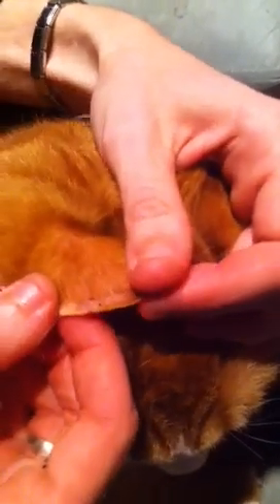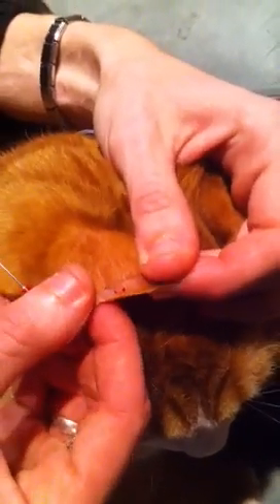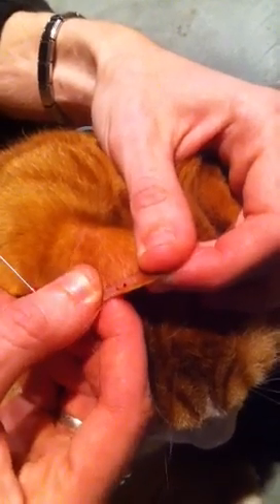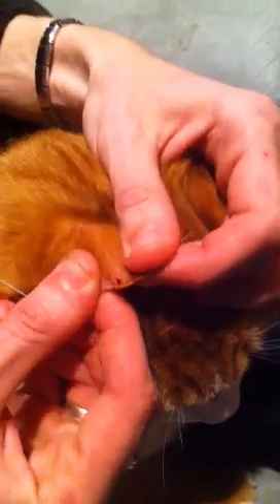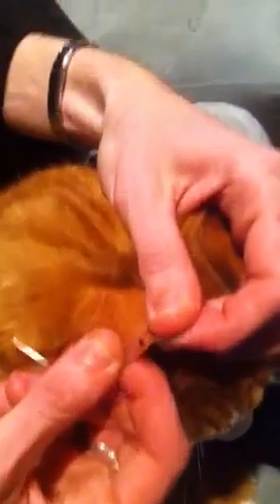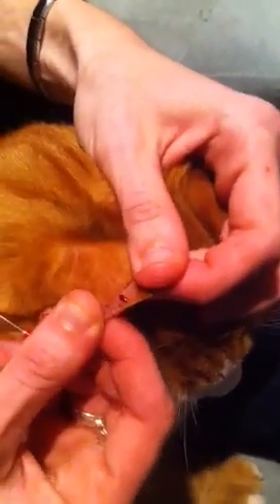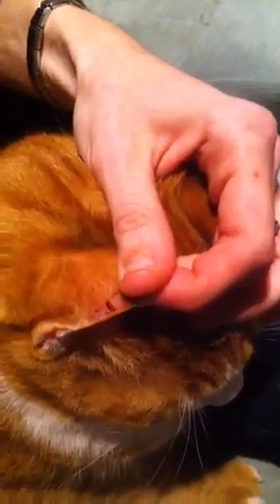If it doesn't start to come out — and actually I should have said this first — if the ear feels particularly cold when you start, massage the ear until it's warm, in the same manner that she's massaging now, except she has already stuck the needle in. In order to make a bigger drop come out, you can see what she's doing with her thumbs — just rubbing back and forth, getting a nice drop.